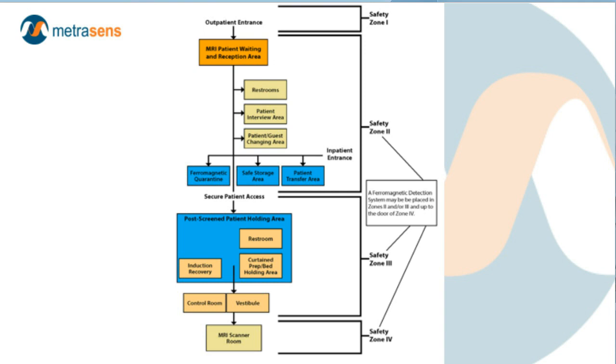But essentially what we're doing is we're associating Zone 4, the room with the giant superconducting electromagnet, as we go from public spaces towards that MRI. Depending on the relative levels of risk, we increase, as I say, screening, supervision, and we ratchet up the access controls, access restrictions to be able to move further in this pathway. That's the general principle of the ACR 4-zone model.